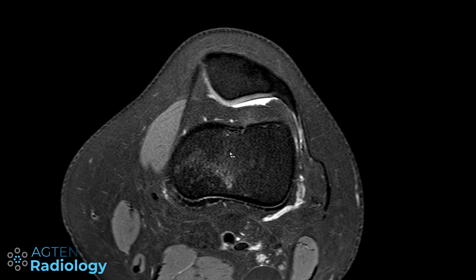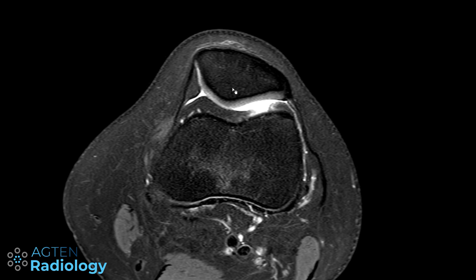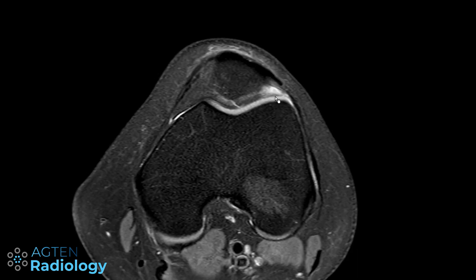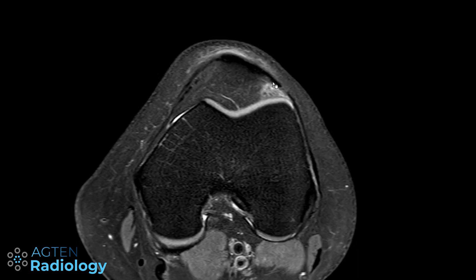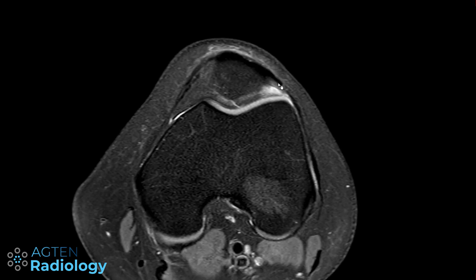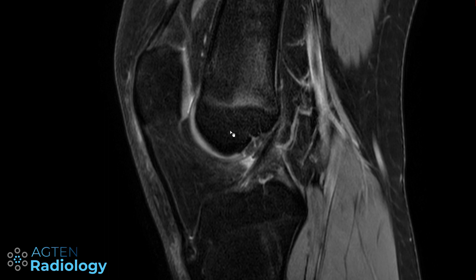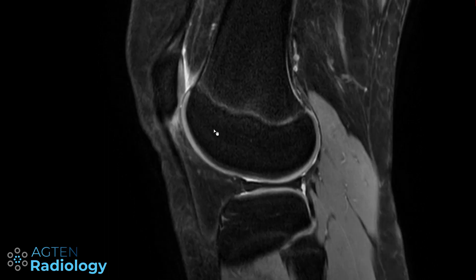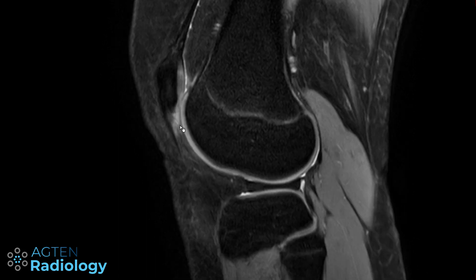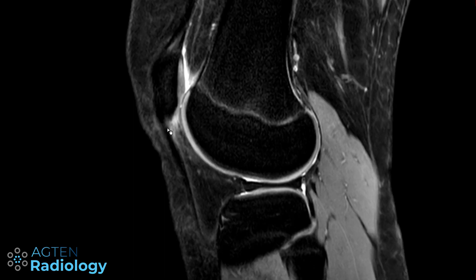This is the next case — similar finding. We go through the level of the patella on our axial sections with fat saturation and fluid sensitivity, then scrolling down we start to see a subtle edema here between the patellar tendon and the lateral femoral condyle, consistent with supralateral HOFA impingement or patellar tendon lateral femoral condyle friction syndrome. On the sagittal proton density weighted fat saturated sequence, scrolling laterally, you can see the distance is narrow as well — not as narrow as in the first case — but you can clearly see the edema between the patellar tendon and the lateral femoral condyle.